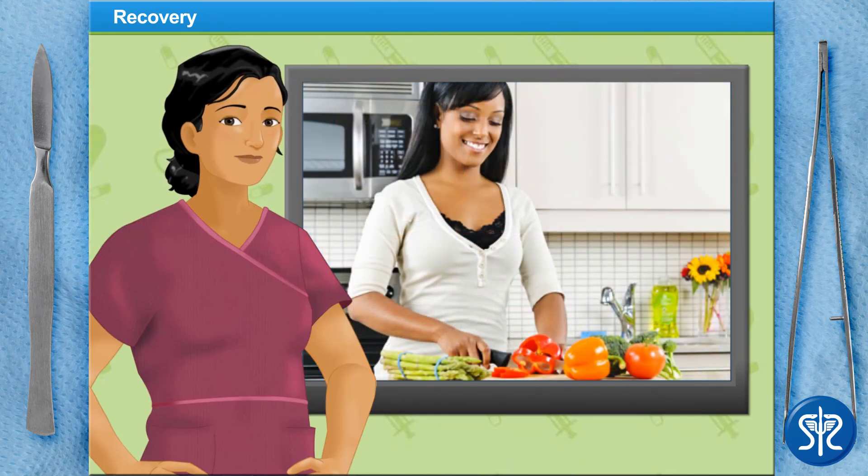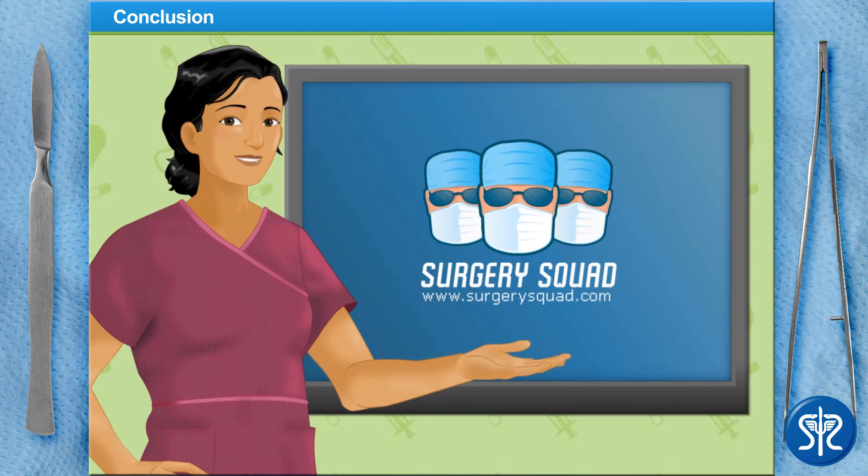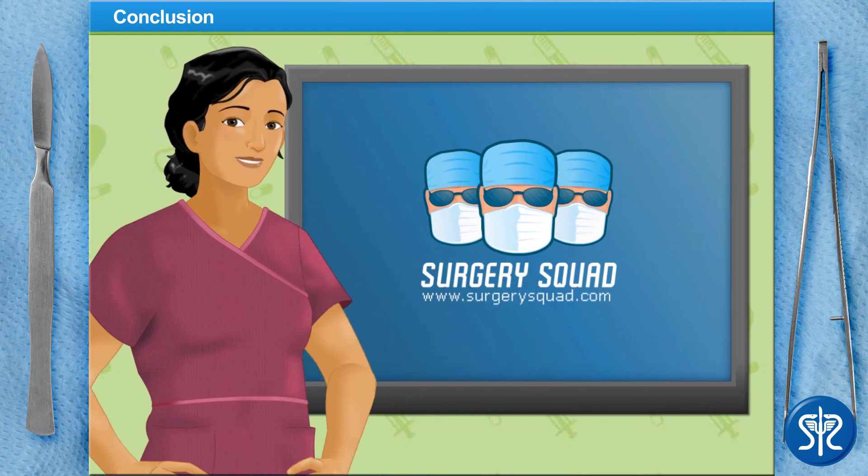Although the suctioned fat deposits are gone, if the patient does not maintain a proper diet and exercise regimen, the remaining fat deposits could enlarge, creating irregularities in the patient's abdomen. And that's abdominal liposuction. You've done a fantastic job. Why not try your surgical skills in another great surgery here at SurgerySquad.com?